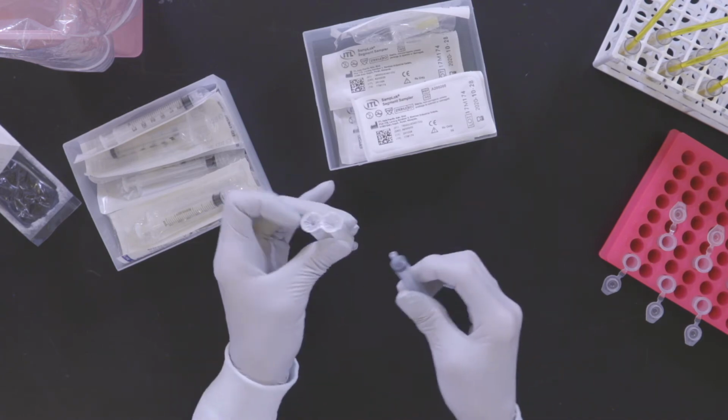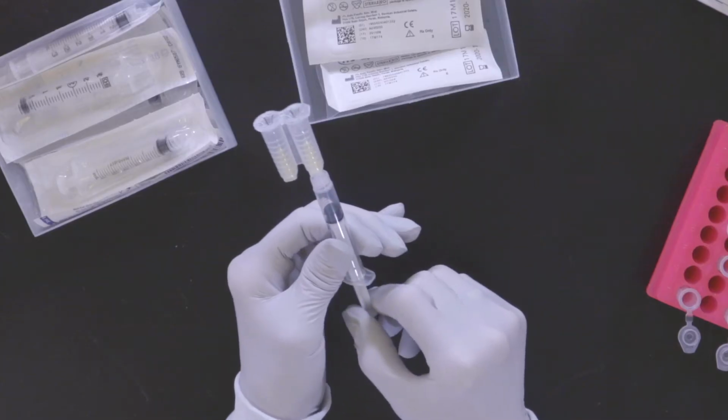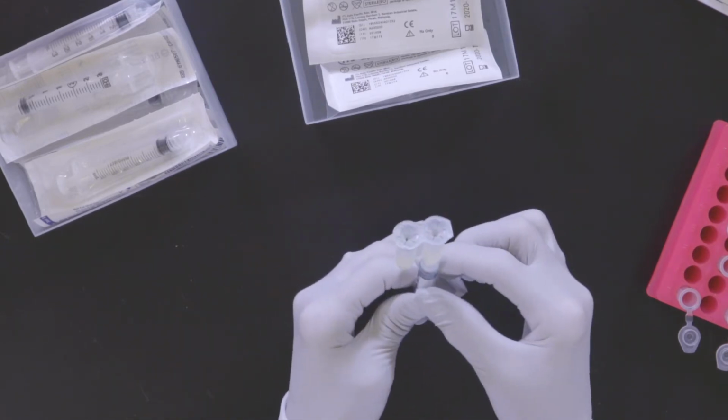Attach the syringe to the segment sampler syringe port. Now, gently break the syringe seal by gently pulling and pushing the plunger back and forth. Breaking the syringe seal can also be done before attaching the syringe to the segment sampler.